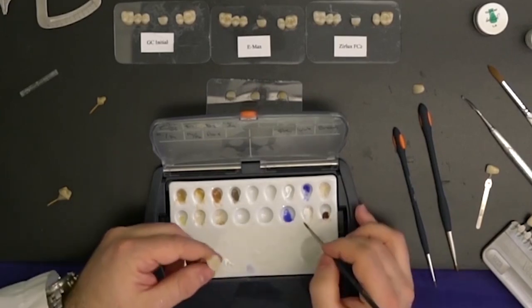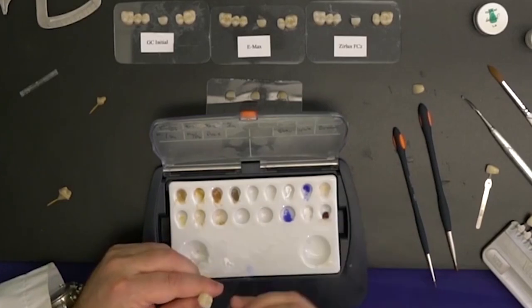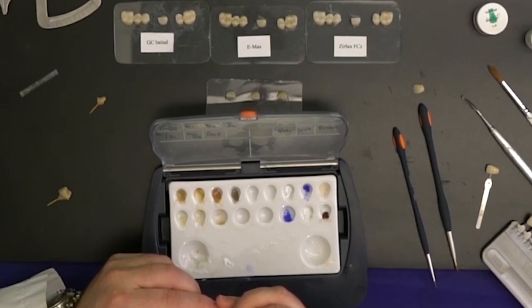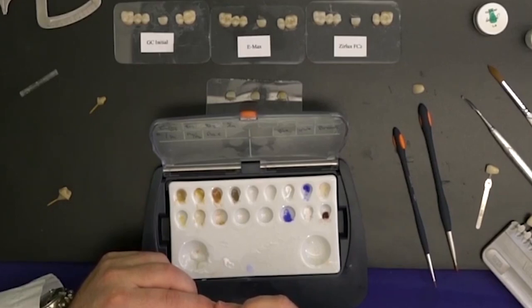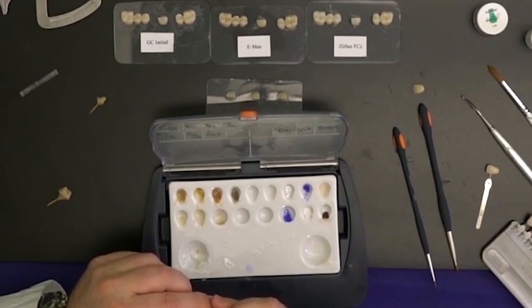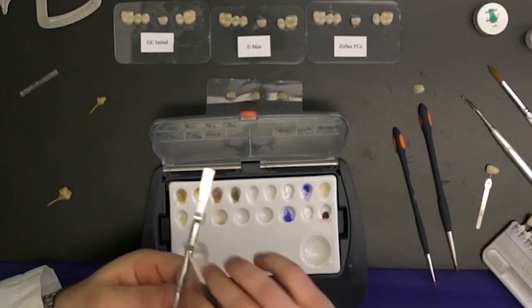On posterior teeth, when you place a little bit of white right at the cusp tips as well as the marginal ridge, it really makes the occlusal table pop. In nature, that's where you often find slight calcifications right at the cusp tips, so I emulate the same thing. As you see here, it kind of really pops out and looks like a really nice restoration — so quickly and easily within five minutes you can achieve some fantastic outcomes.